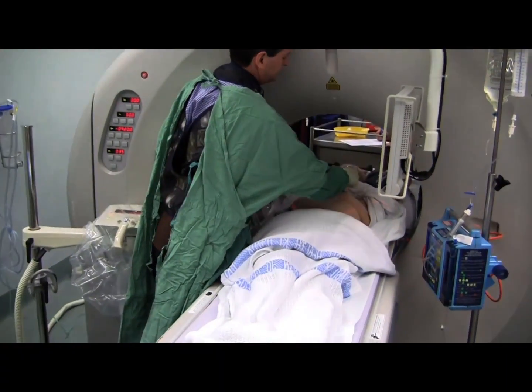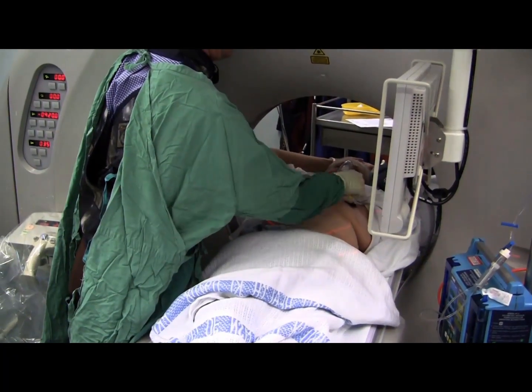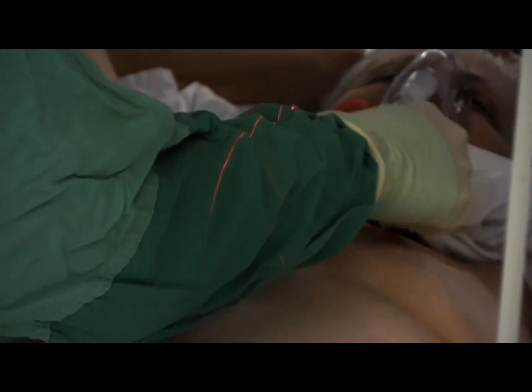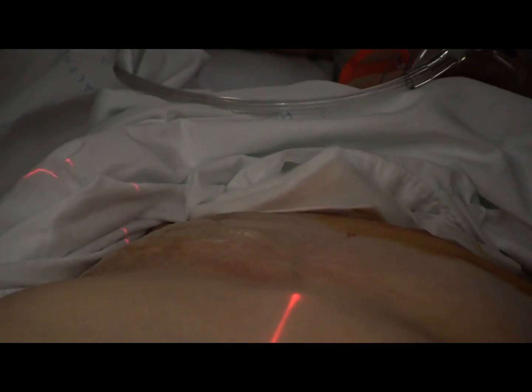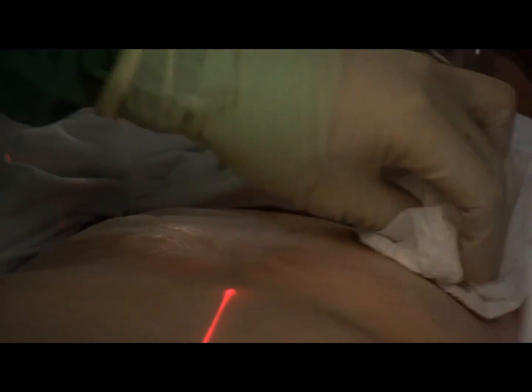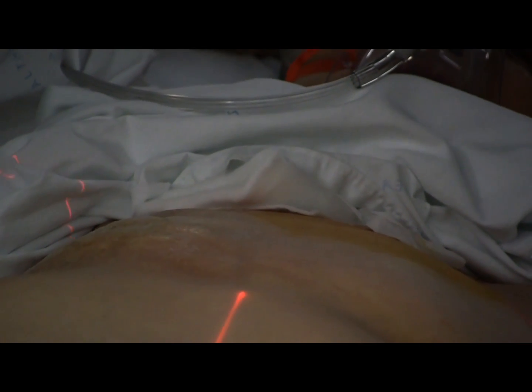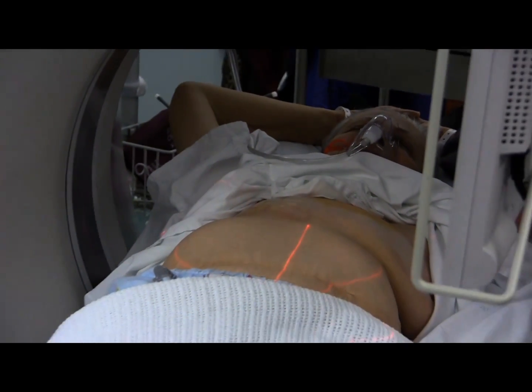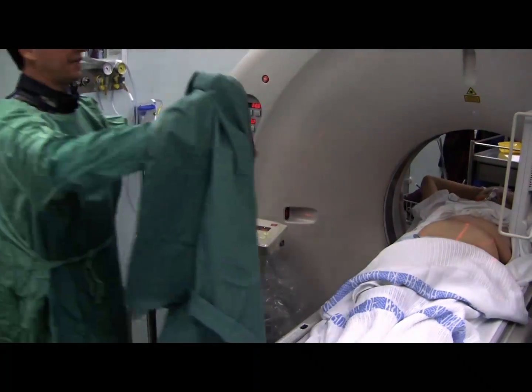Switch on the laser, bit of skin prep. We've got pulse oximetry and blood pressure monitoring, intermittent blood pressure monitoring here. We're not doing ECG monitoring. We don't normally ECG monitor for a case like this, even in this location. We'd have a problem with the ECG leads as is. So a bit of skin prep, a bit of drape, and then start with the local anaesthetic needle to work out exactly what trajectory is going to work here today.